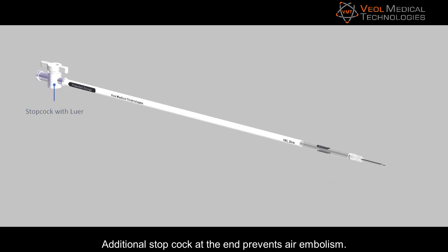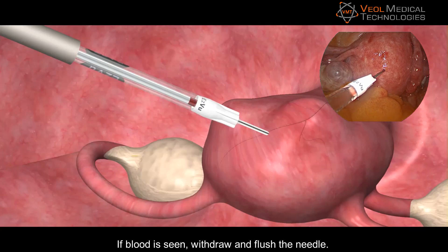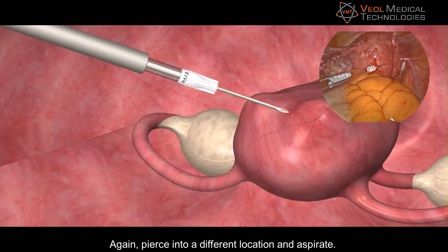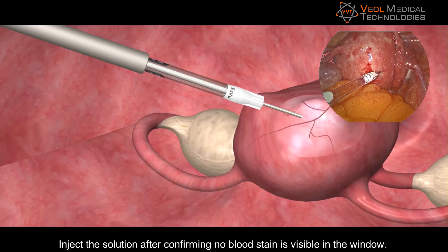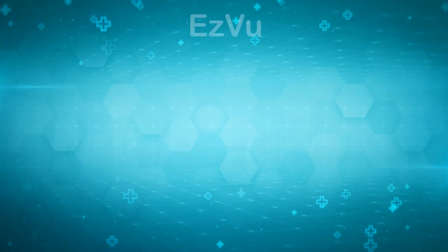An additional stopcock at the end prevents air embolism. Aspirate and look for blood stains in the clear window. If blood is seen, withdraw and flush the needle, then pierce into a different location and aspirate. Inject the solution after confirming no blood stain is visible in the window. This remarkably reduces the chances of inadvertent intravascular injection and increases patient safety.